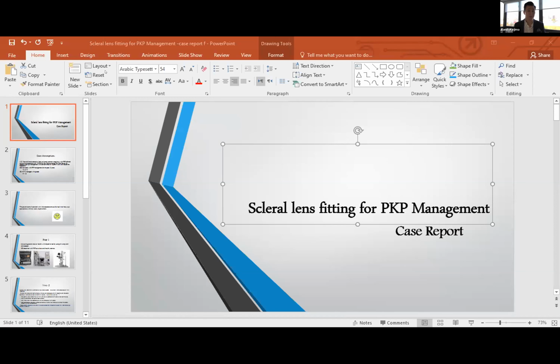No, we don't have any study that suggests that the lack of tear exchange is a concern. Interesting, because we've been trained that every contact lens needs to move, every contact lens needs to exchange fluid. I think a corneal GP exchanges 100% of its fluid within 5 to 7 minutes.